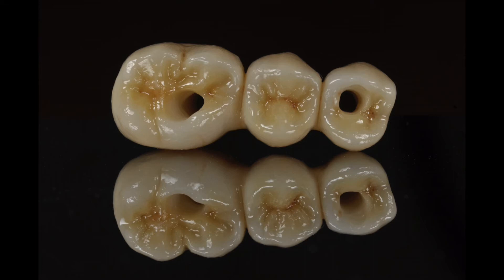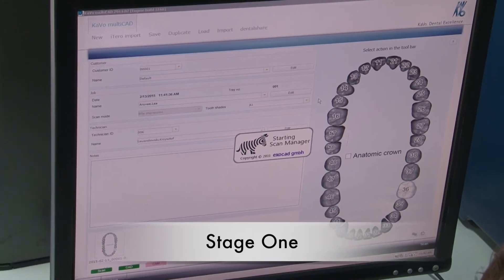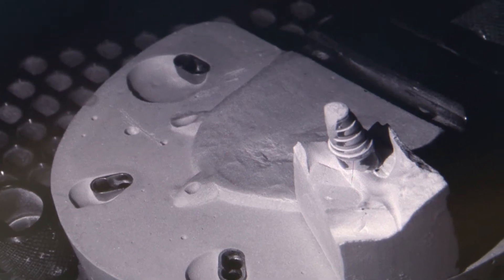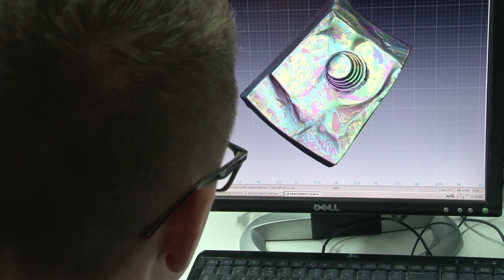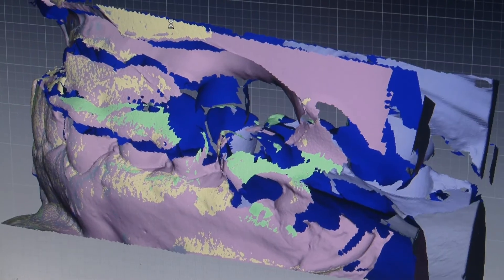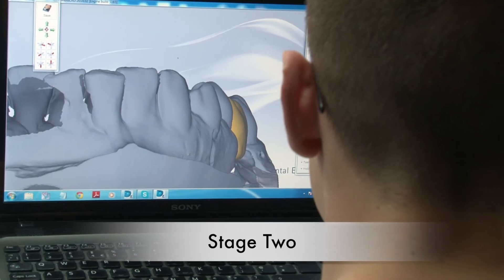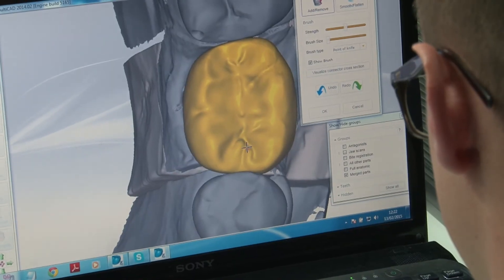So, how is it made? To begin, the scanning model with a prepared tooth or implant is put into a three-dimensional scanner using red light laser or blue light technology and scanner software. After the scanning process, the image is imported to CAD — computer aided design software — where it will be designed for final restoration.